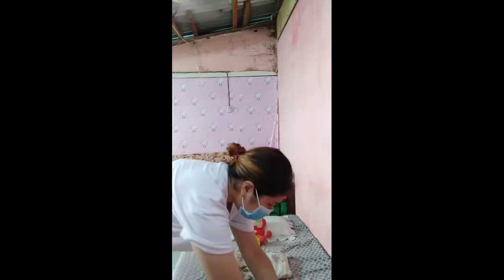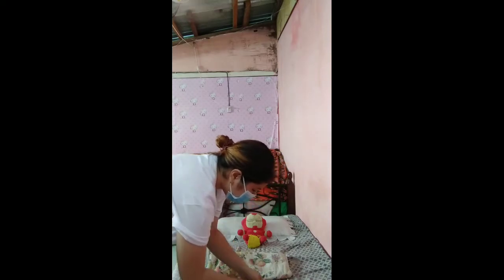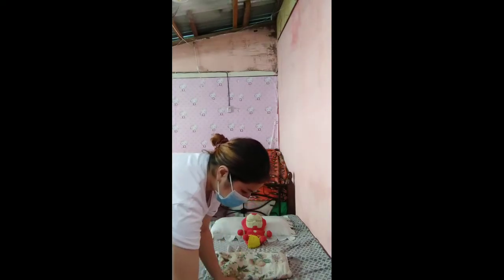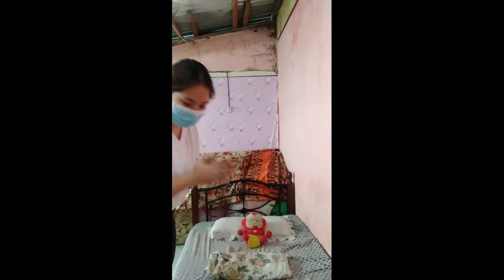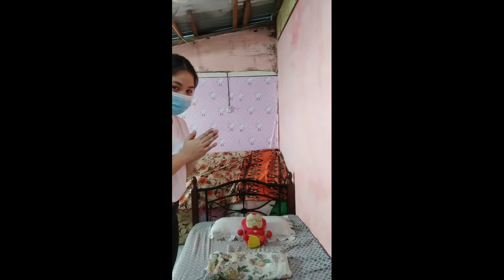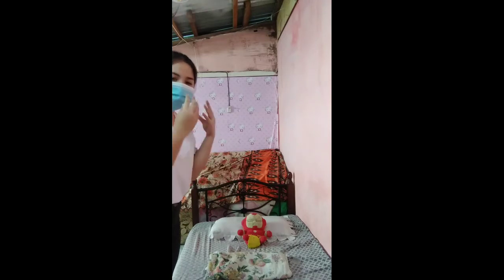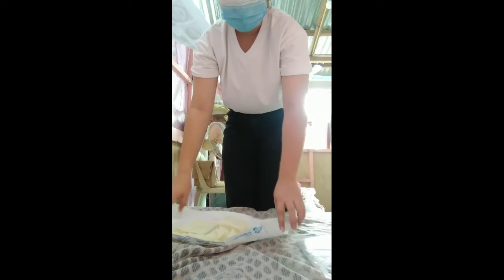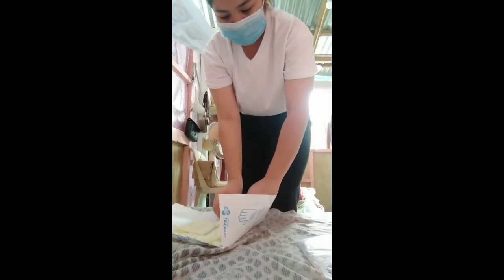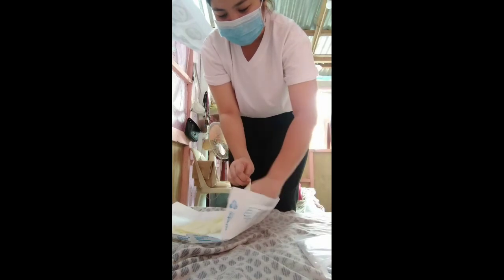So I have here the materials for catheterization. After preparing the materials for the catheter, we need to put on sterile gloves in our hands to prevent contamination. So I have here the sterile gloves. So we need to put these on to perform the catheterization.